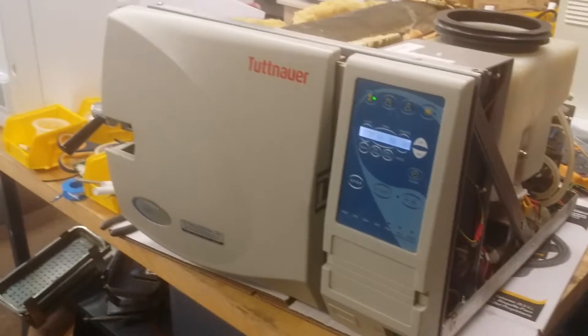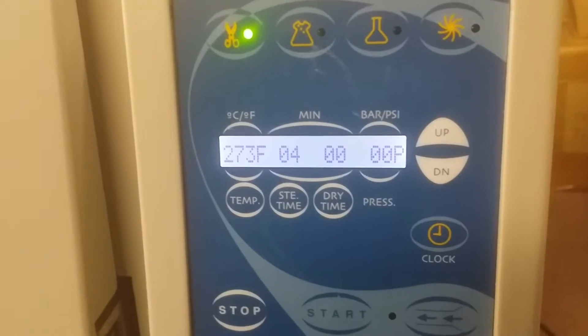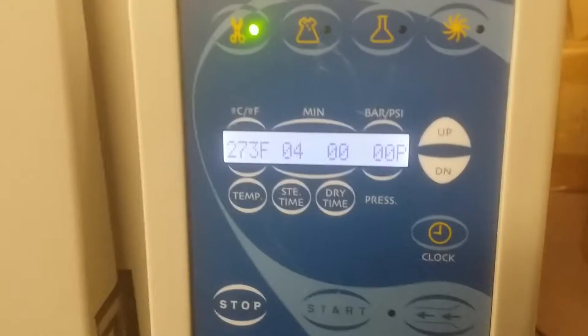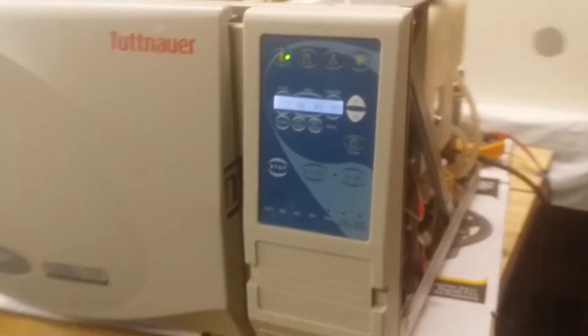If you have any questions or problems, normally you can see the error code on the display board. Please make sure before you contact us, write down what error code you have — it will be very helpful. Some machines come with a printer, which is also very helpful. You can make a copy of the printout and email it to us.